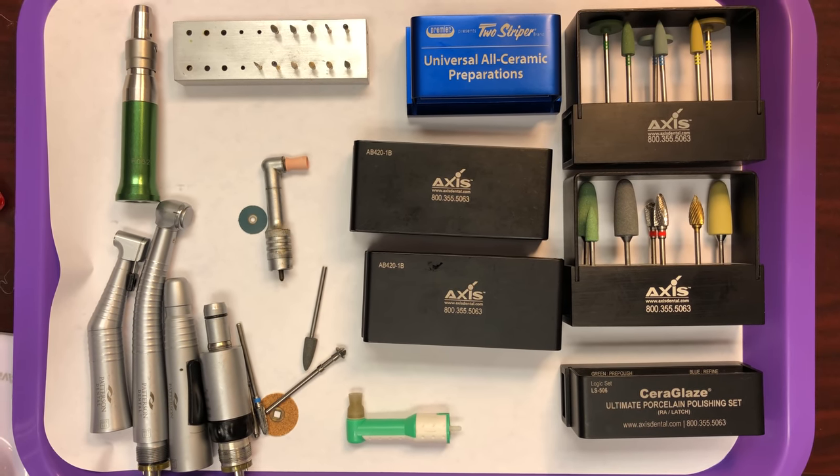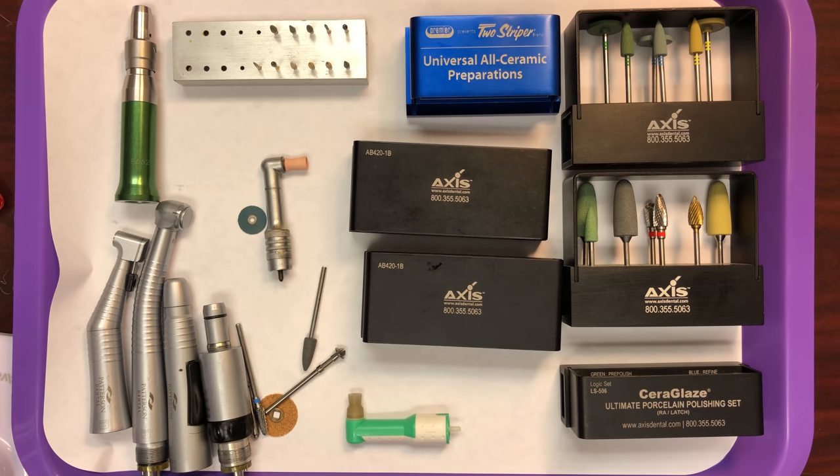Hi everyone. This video is going to introduce us to some of the most commonly used burrs. Our main focus is going to be on restorative burrs, but I also want to show you the variety that is out there. We have finishing burrs, burrs specific for different materials, as well as some diamond burrs.